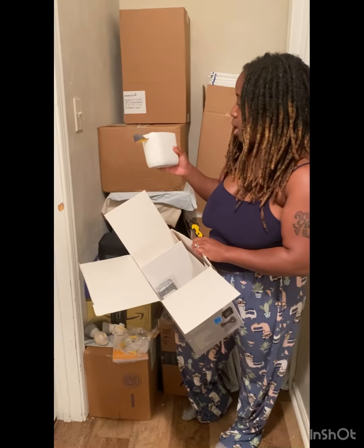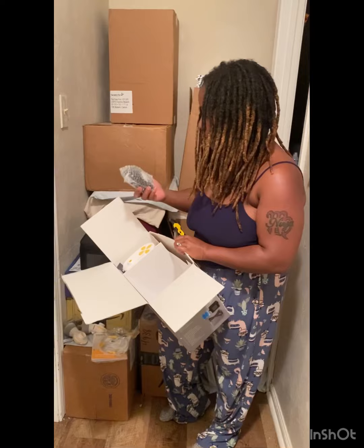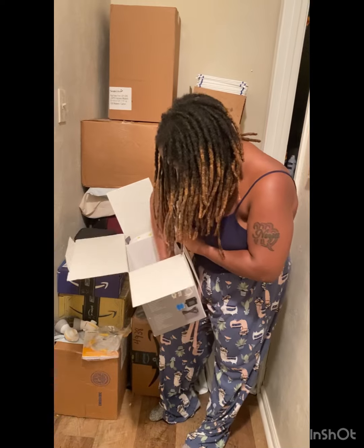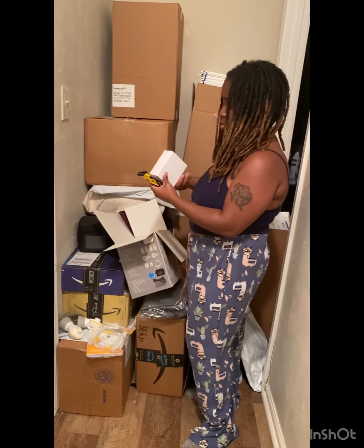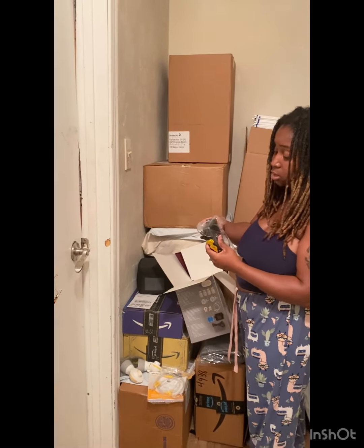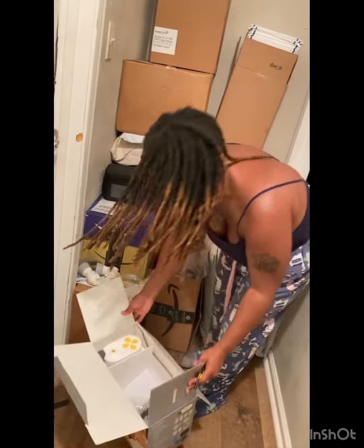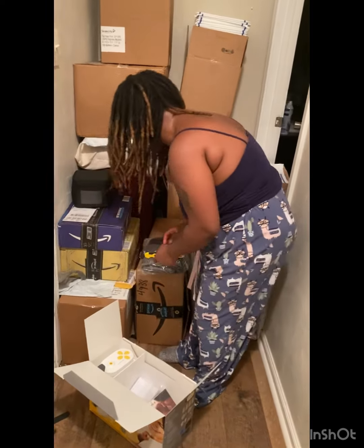This is a little pump thing right here. Y'all, I can't think right now. But this is a little thing that you turn on and off — the little pump thing or whatever. And this is the little other thing that you plug in. Y'all, this is a lot of stuff. And this is the other pump thing. Let's see what's in this box, you guys, real quick. This is the Medela stuff.